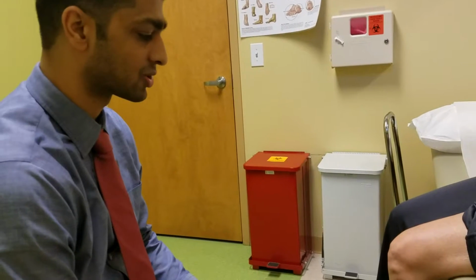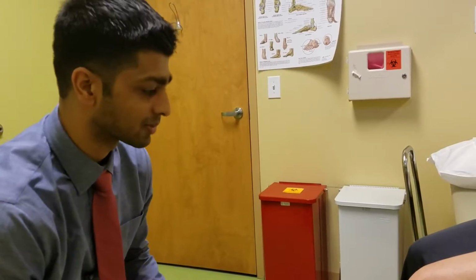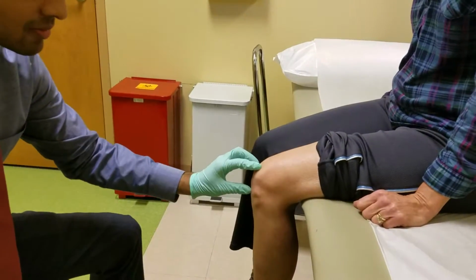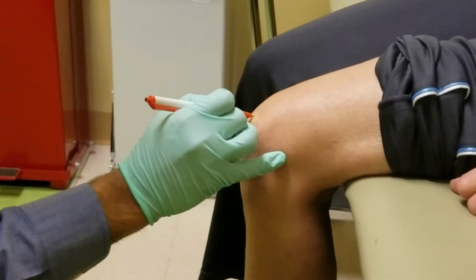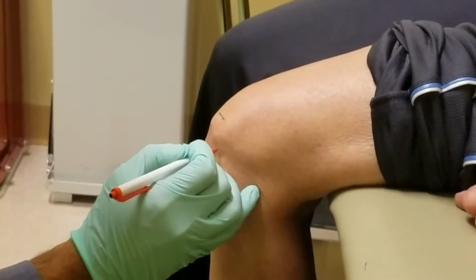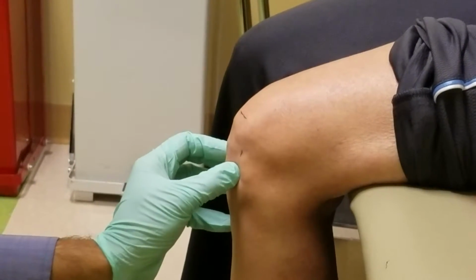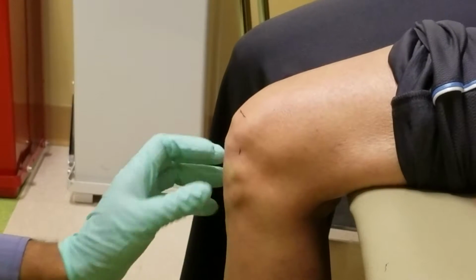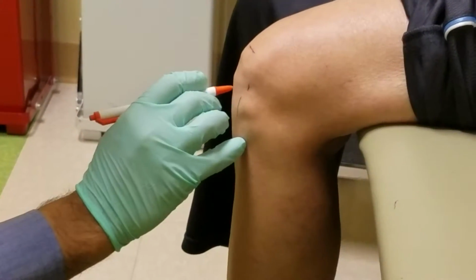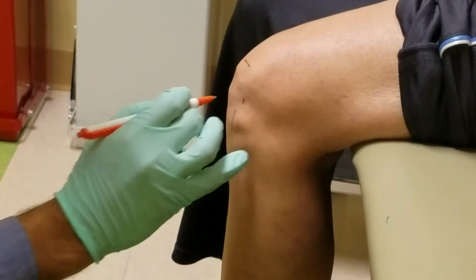So anytime doing this injection, main things you look for are anatomical landmarks, which include mostly the patella initially. So I'll palpate the superior pole of the patella. You can mark it out with a marking pen, and the lateral portion of the patella, inferior pole of the patella, and then you can actually palpate, generally in most patients, the edges of the patellar tendon. So in this patient's knee, I'm going to draw those as 2 lines. That's basically the lateral edge there and medial edge of the tendon there.